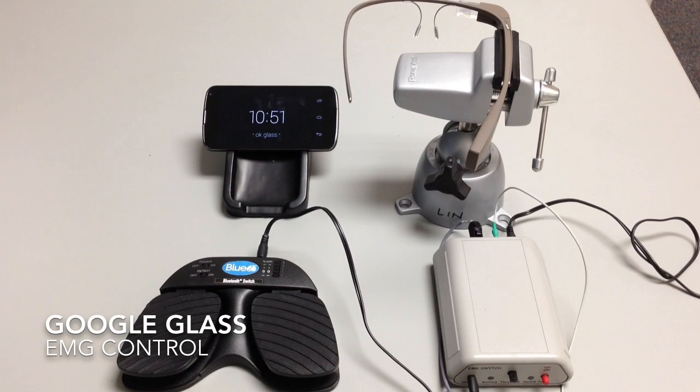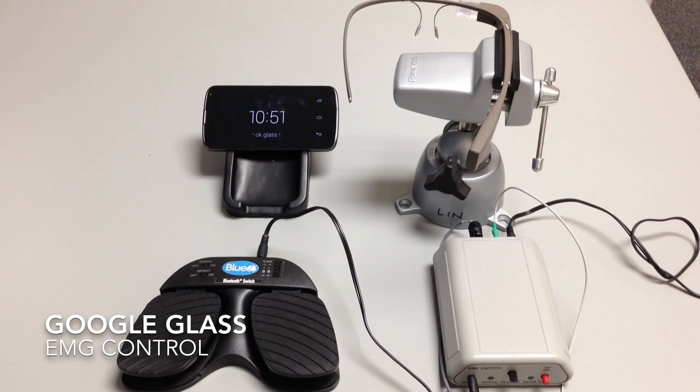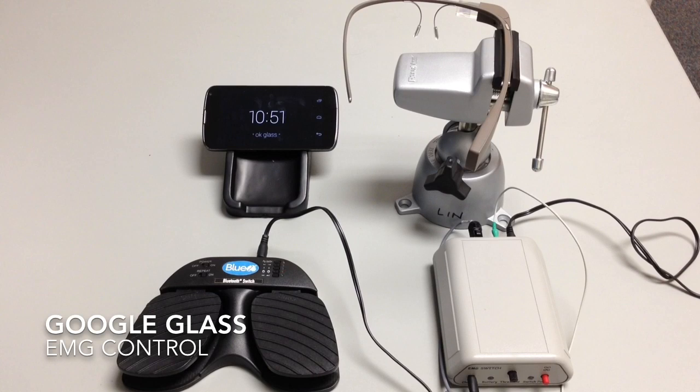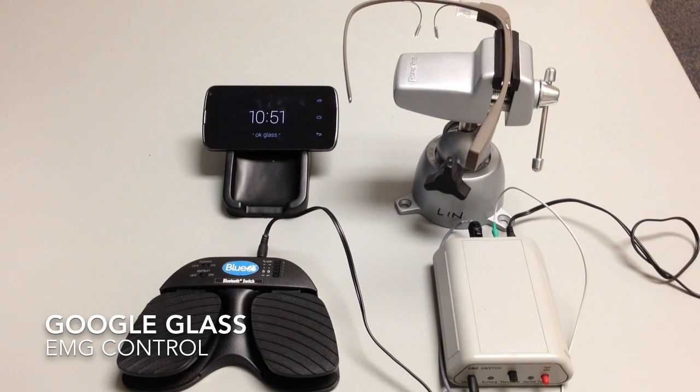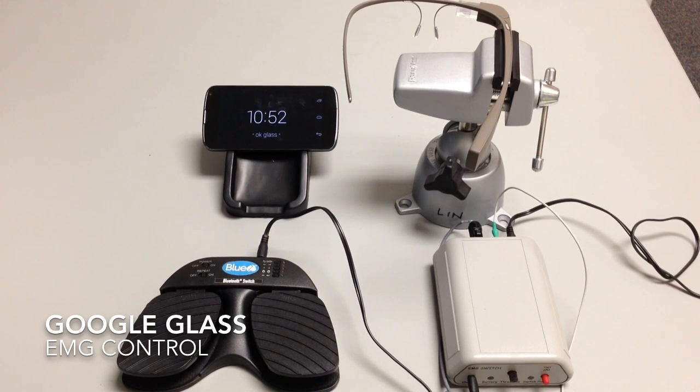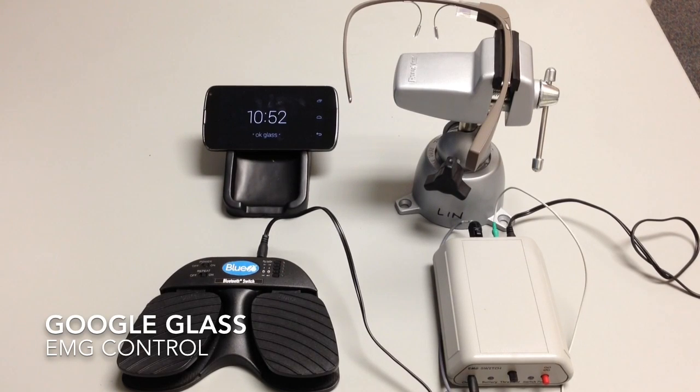Hi, this is Andy Lin from Google Glass Accessibility. Today I'm going to show you how a Bluetooth switch can be interfaced with an EMG switch which detects muscle activation firing.